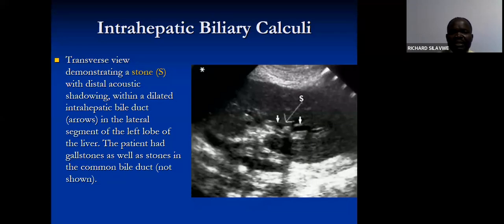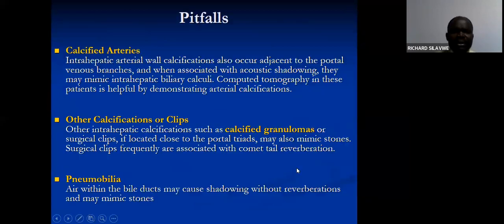So that's a sonogram there. We can see the arrow pointing to the stone, and the stone is casting a shadow here. Okay, can go to the next slide.